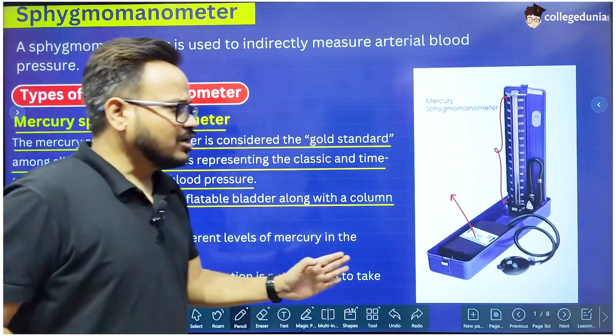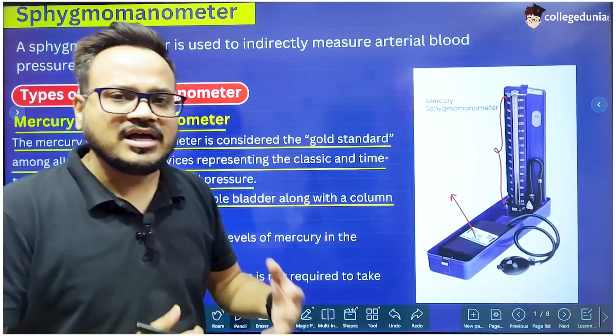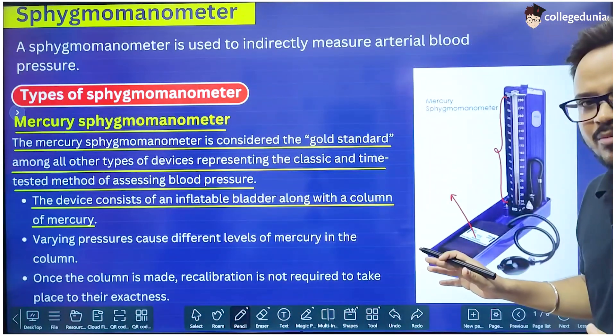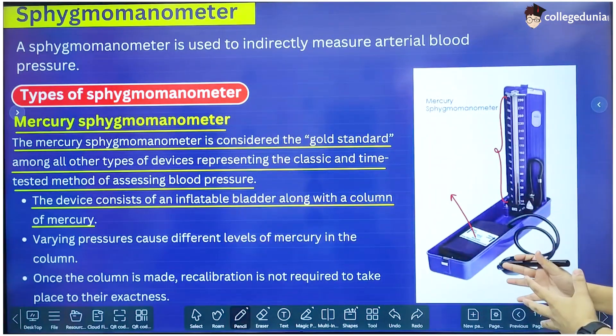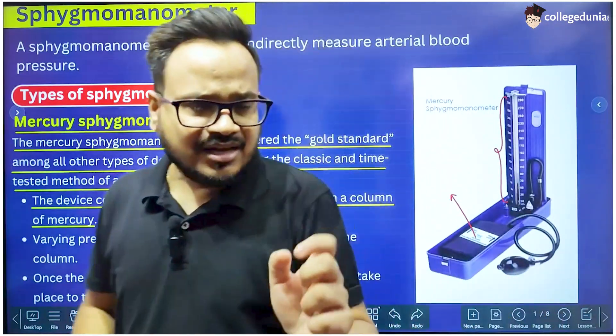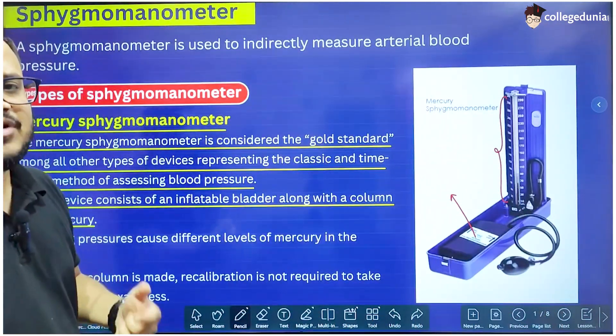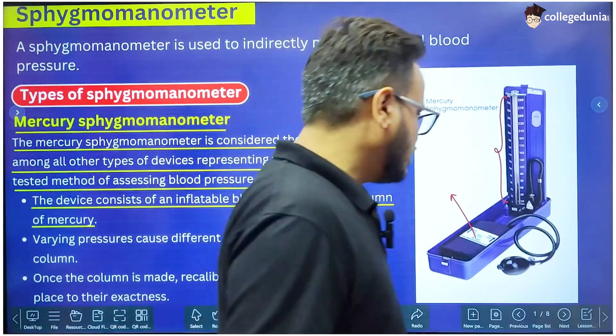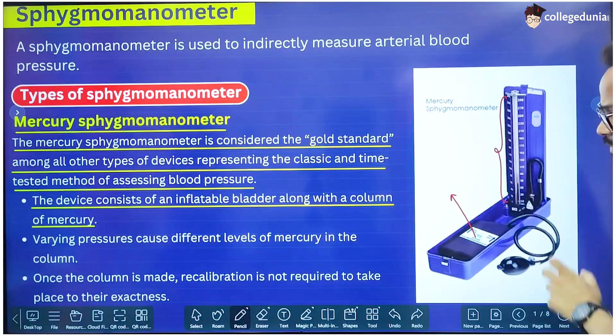Once it is set up, we do not need to calibrate it again and again to get the readings. That is the best part of the mercury Sphygmomanometer. Other manometers must be calibrated every now and then because they start giving different or wrong readings. That is not the case with the mercury type, so this is the best Sphygmomanometer available.